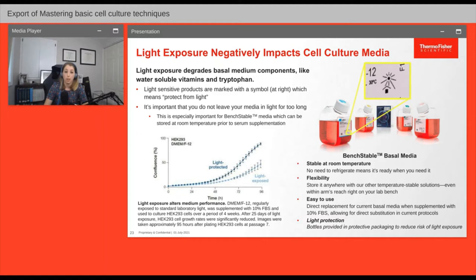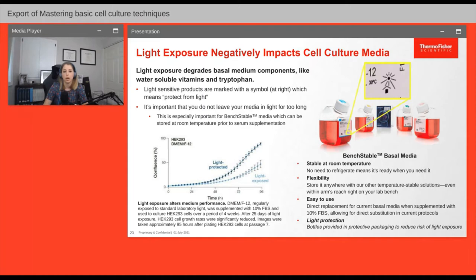This is especially important for our bench-stable basal media, which can be stored at room temperature before being supplemented with serum — that's why it comes in a cardboard box to protect it from light. All media and many other cell culture products are sensitive to light. If your lab has refrigerators with glass doors, consider covering the glass, and if you store media in a cold room, turn the lights out when you leave. Keep an eye out for that symbol to keep your media and reagents working at their best.